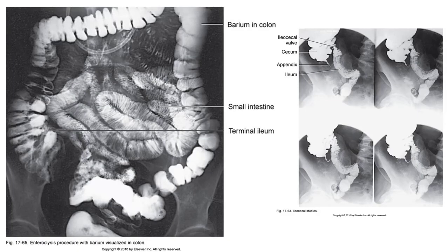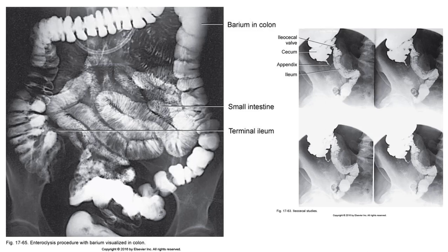Here we can see the entire large intestine has been filled with barium through to the rectum. The images on the right are spot films taken by the radiologist to document appropriate spilling of contrast through the ileocecal valve and into the cecum.